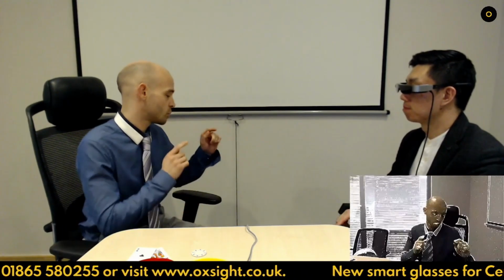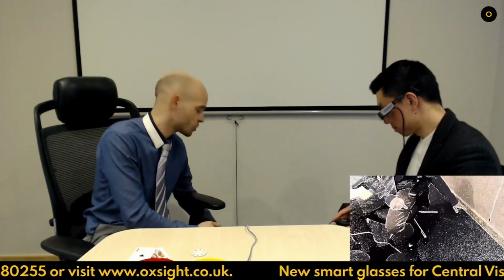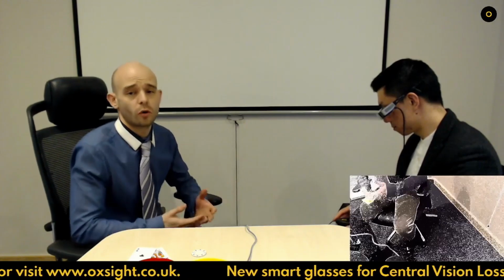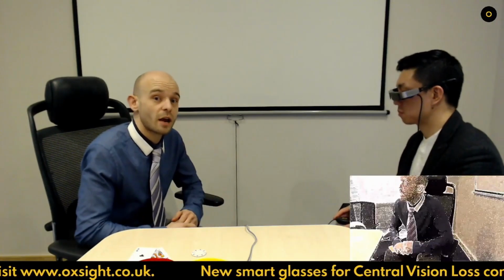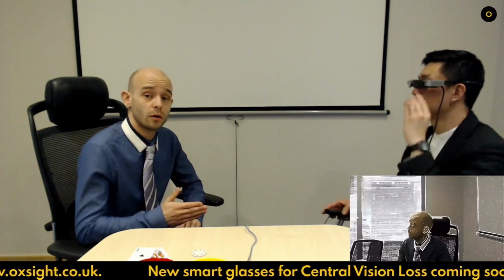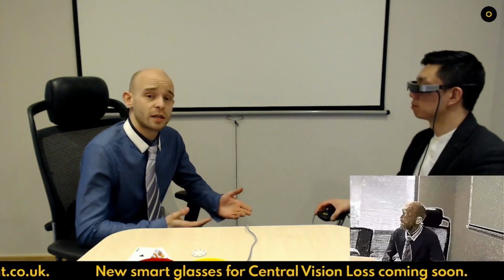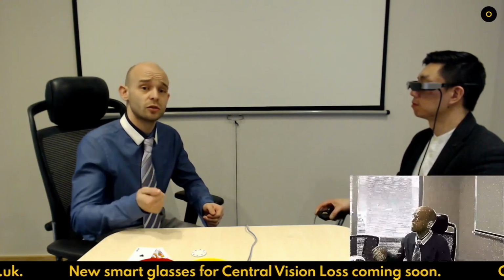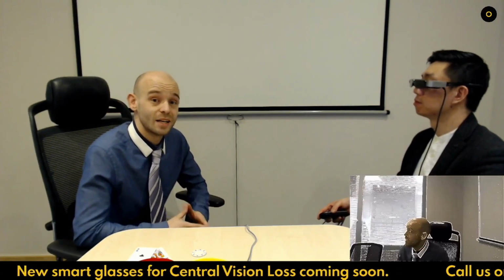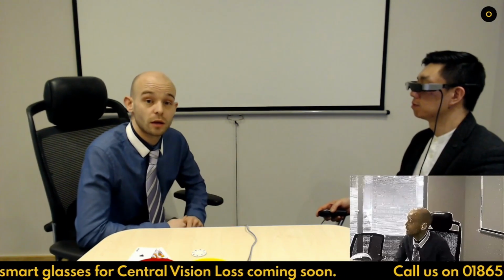Now this mode is really good if you are in an area where the contrast is quite poor. For example, if you lower your chin just down to the table, you'll see the skirting boards have been highlighted, the bottom of the chair's been highlighted. So if you have to go to an area where you've not been before, or somewhere that's unfamiliar, you can look with the outline and make sure that you're not going to trip over objects. You can put the glasses around your neck and navigate to where you need to go, because you know where the chair legs are, you know where things are in that room. It just makes life a little bit easier in an unfamiliar environment. So that's one good thing about this normal mode.